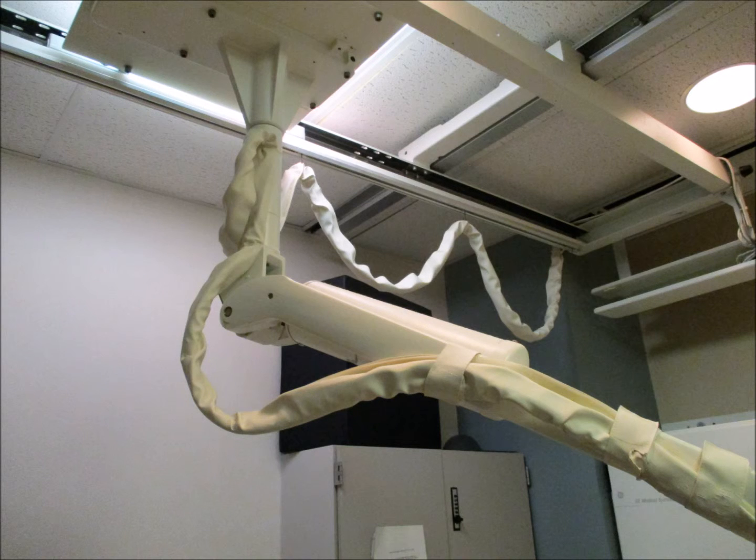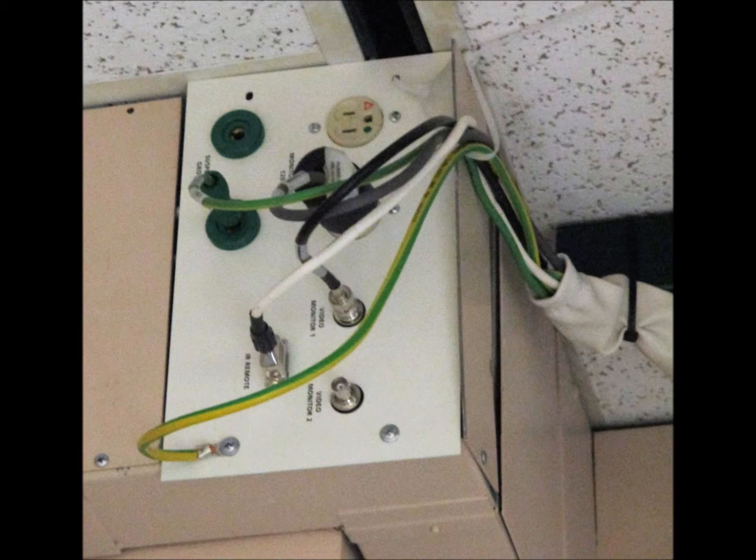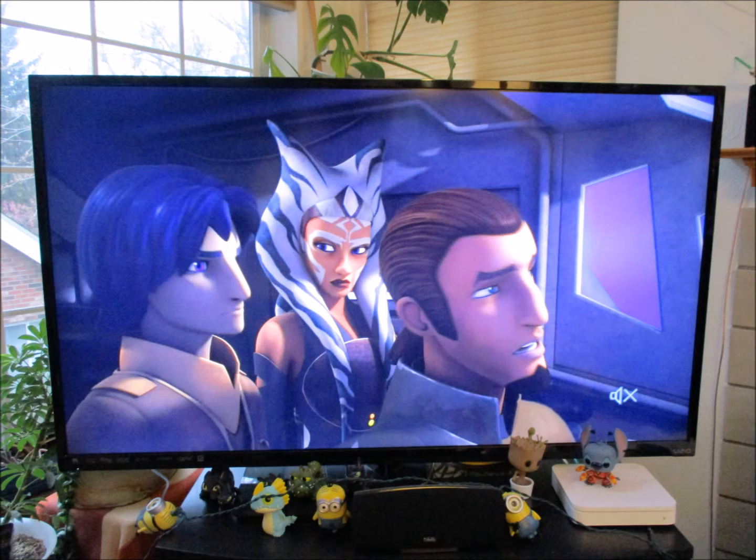First carried through a fiber optic cable to a CCD. Sounds like a school for you and me. But no, this is the ADC, where I'm converted digitally for the human eye to see and back to light photons. Hope it's a 3K monitor for me, cause I'm worth it and technologists deserve it.